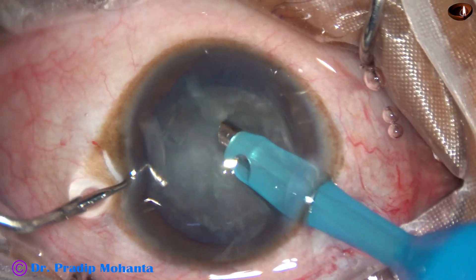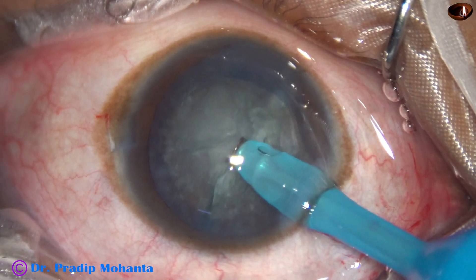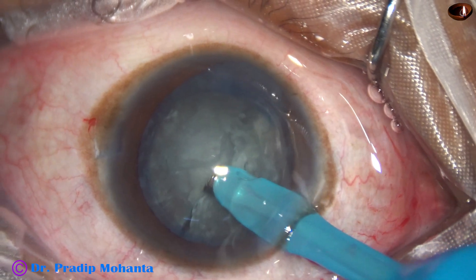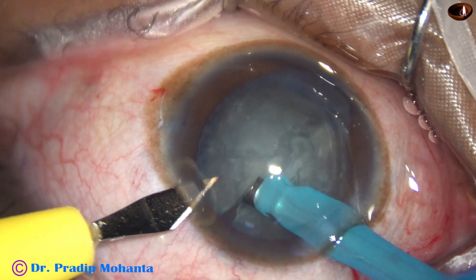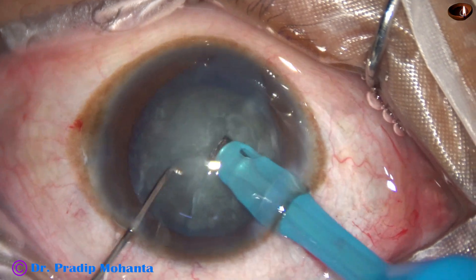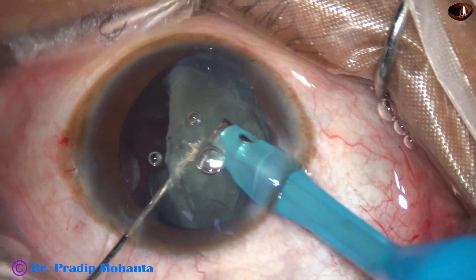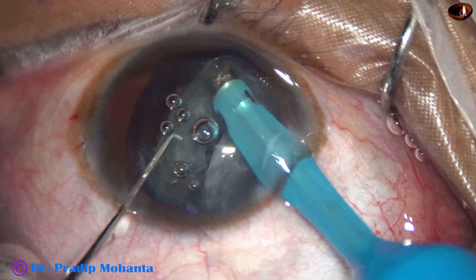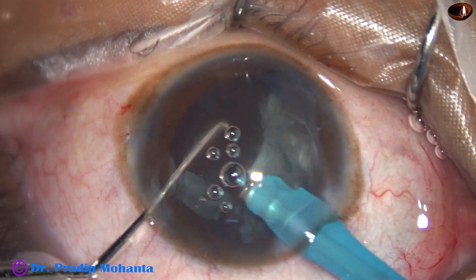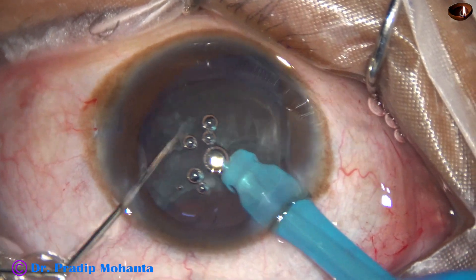Now I am going to divide each hemi-nucleus with vacuum and the ball-tipped chopper. The side port was too far, so I made another side port here. This hemi-nucleus is being emulsified — it is done, no problem till now.